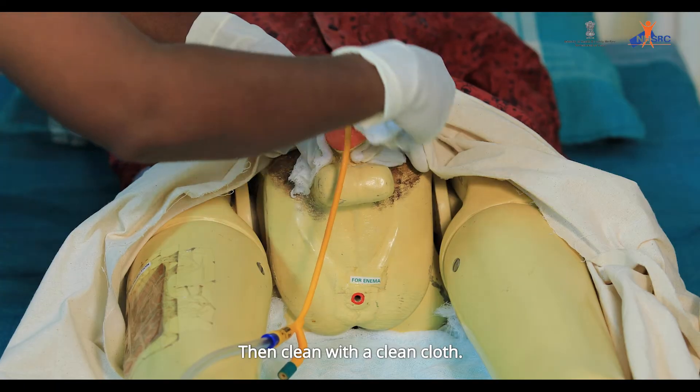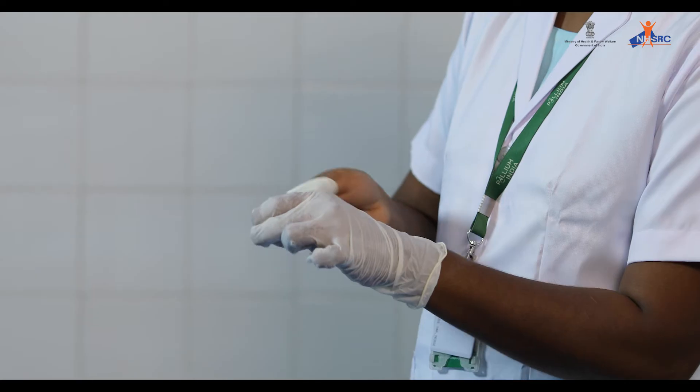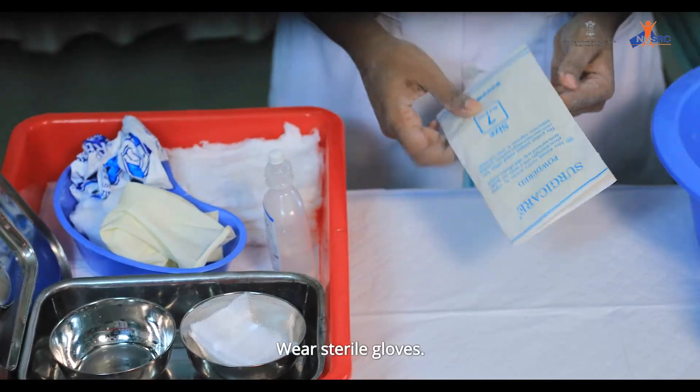Then clean with a clean cloth. Replace foreskin to its position. Remove gloves. Pour normal saline into the bowl. Wear sterile gloves.